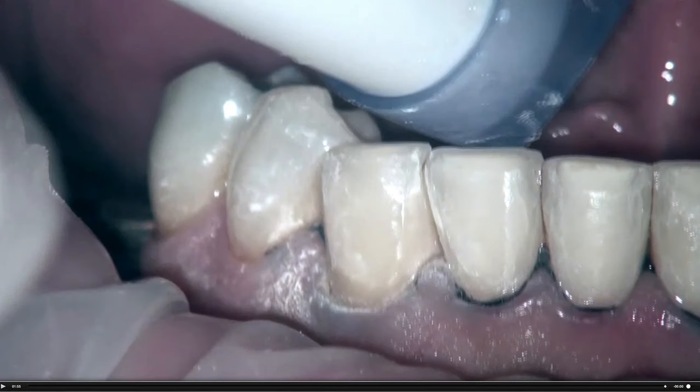You could use this product, or you could use an enhanced cup or point. Those are the different instruments I use on the slow-speed handpiece to round that transition zone. I like something in a slow-speed handpiece so I get a nice smooth rounded contour, as opposed to trying to do that exactly with the diamond — with the diamond you might accidentally over-reduce that area.